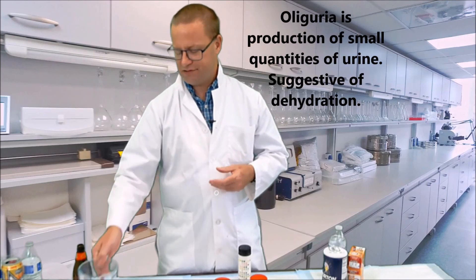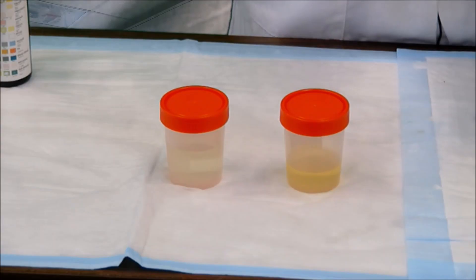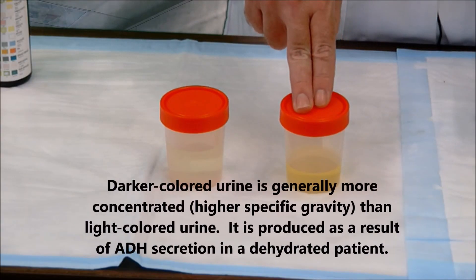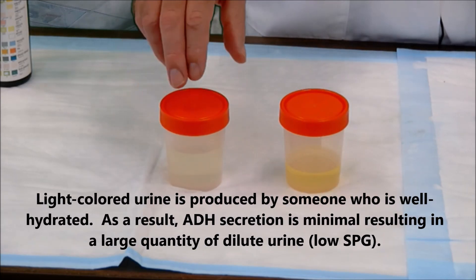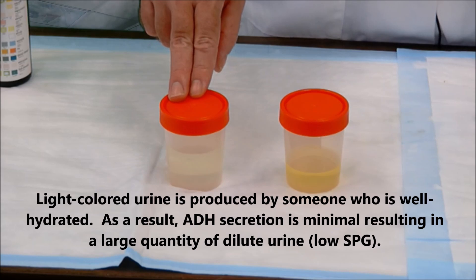You'll also notice differences in the color as well. This sample that I'm touching now is very, very dark yellow, and that indicates a very concentrated urine sample, which should have a higher specific gravity. On the other hand, this urine sample here is very light in color, indicating that the person it came from was rather well hydrated, and they have a very, very dilute urine.